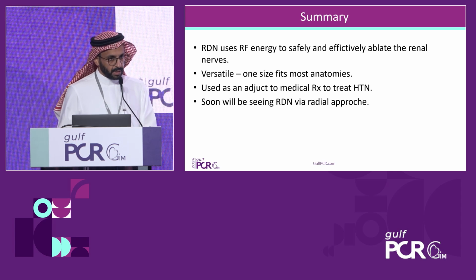And soon we'll be seeing renal artery denervation via radial approach, which will make life easier for the patient as a one-day procedure. Thank you.